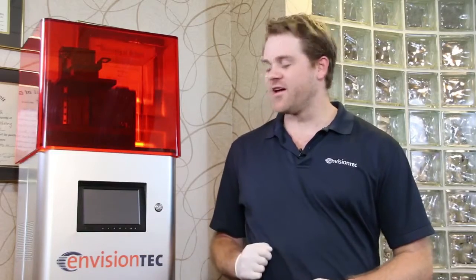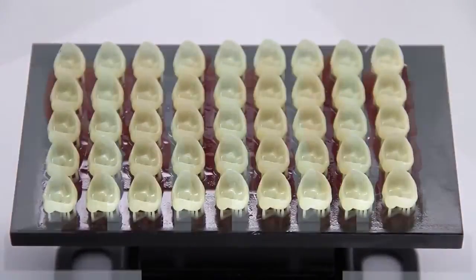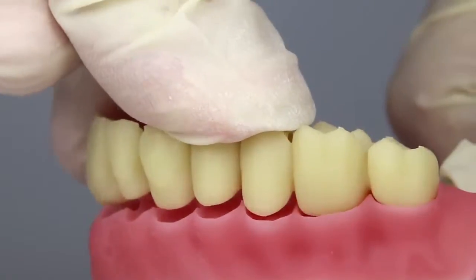Hi, this is Chris Cabot with EnvisionTech, and I'm here with the Perfactory Vita 3D printing out dentures. The eDenture material, when paired with our eDent 400 material, allows for you to 3D print out the denture base as one piece, the teeth as another, and adhere the two together, offering a completely digital denture solution.